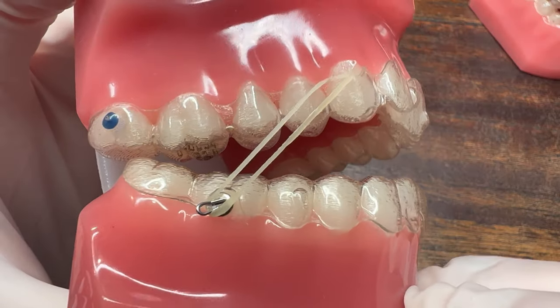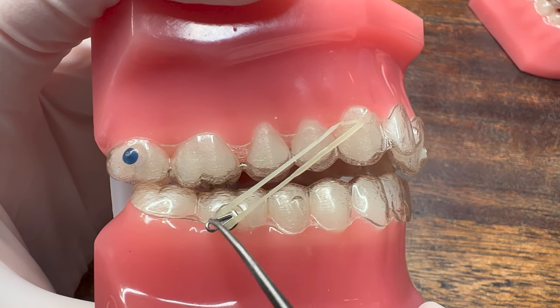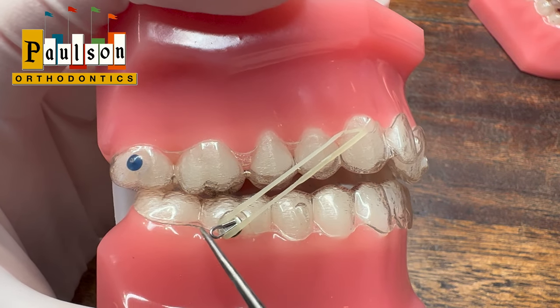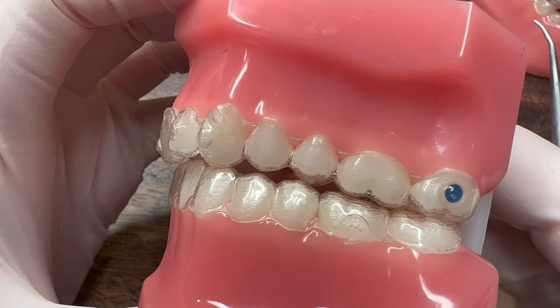Hey, what's up guys, Dr. Paulson here. What do you do if you suddenly have broken off your lower button or attachment for your rubber band and you cannot get your rubber band on your lower section anymore? Here's a little trick that can help.